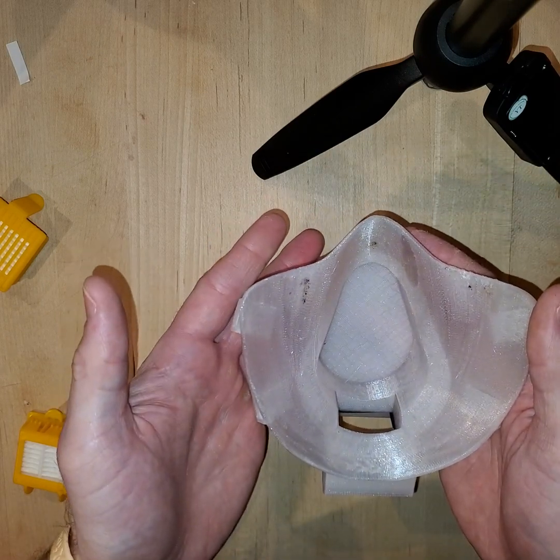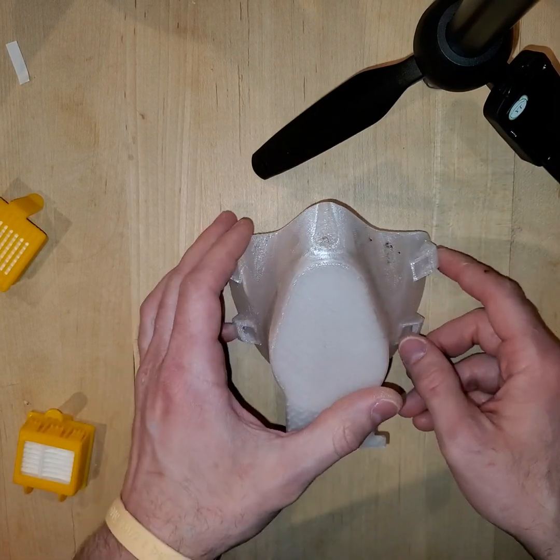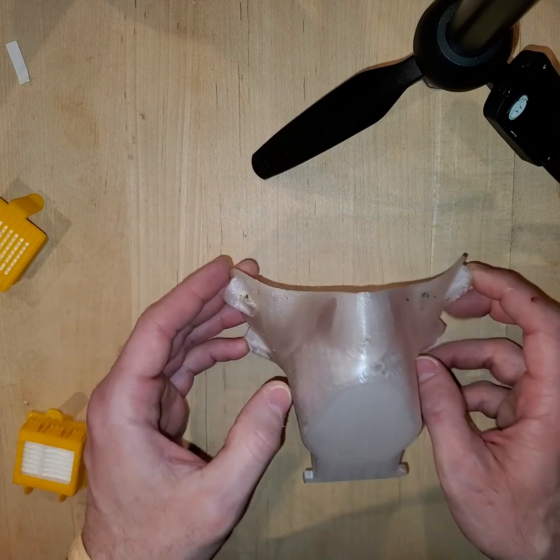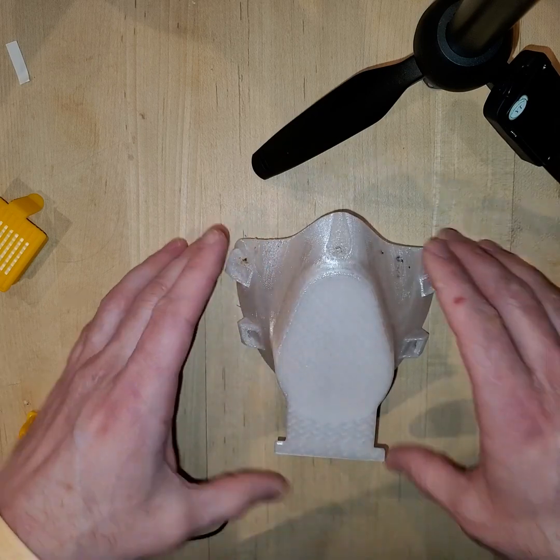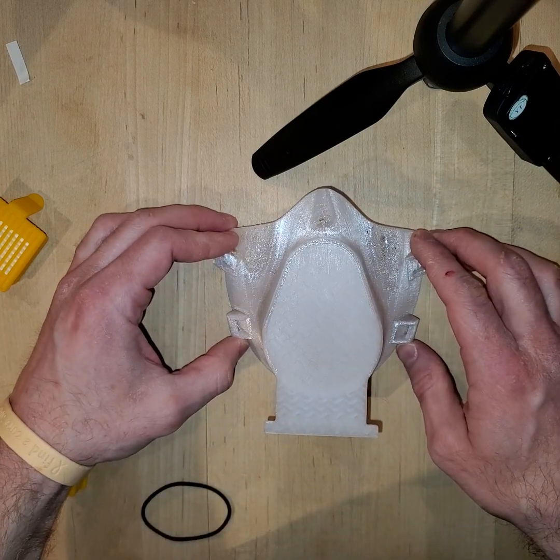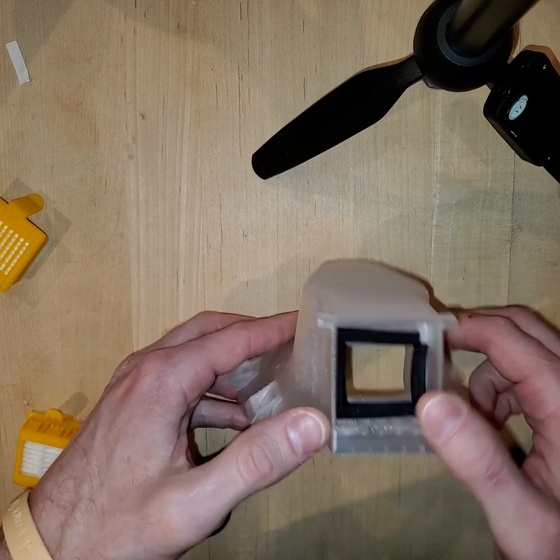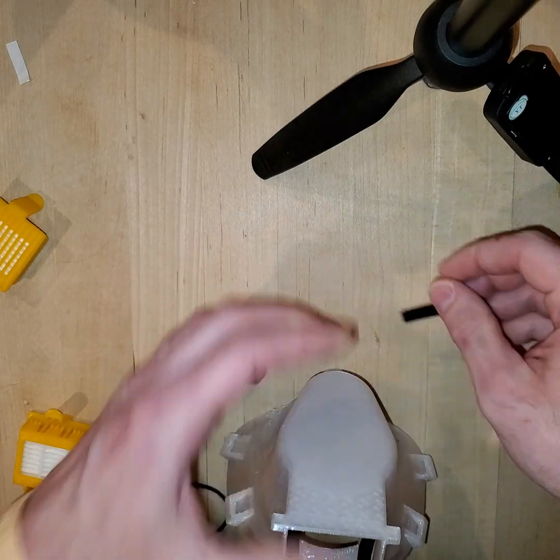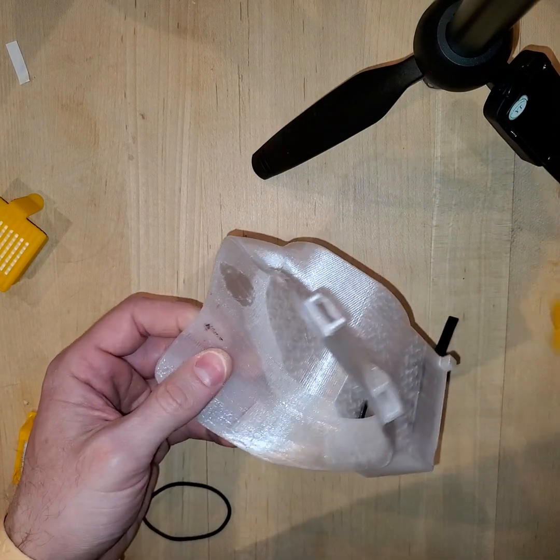I think the large and the medium should be sufficient for the vast majority of people. I might decide to create a small as well, but I need to take a break. I've been working on this for the last few days. Other than that, I think I might not even post other videos. I've pretty much covered it. Just one piece of tape, cut it into two pieces, rip it down the middle as well, and then you've got your pieces there. All right, so pick your poison.